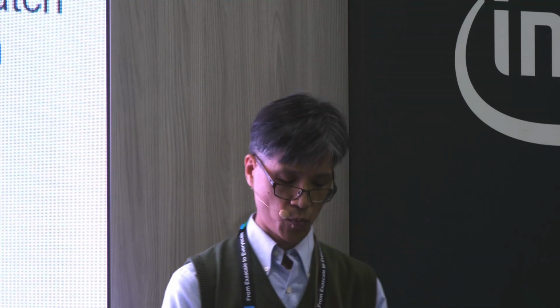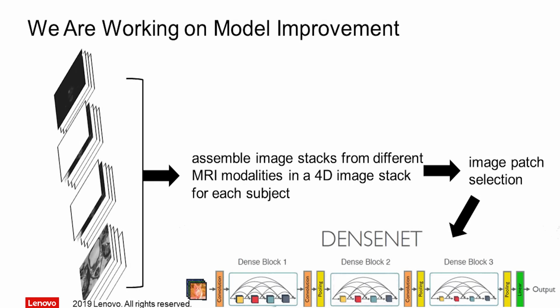Beyond that, we're still working on model improvement. We use a different approach by assembling the image stacks from the 4 different MRI modalities into 4D image stacks before doing the image patch selection. In addition, we choose DenseNet as the backbone, which is one of the state-of-the-art CNN architectures, together with a trainable loss function named the focal loss. Putting it together, we try to improve the model accuracy as well as the model stability.